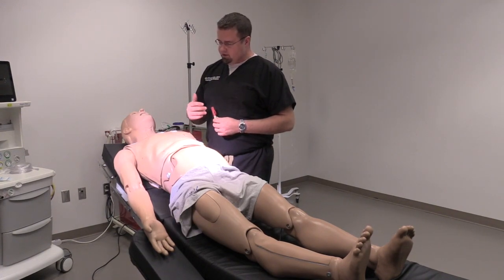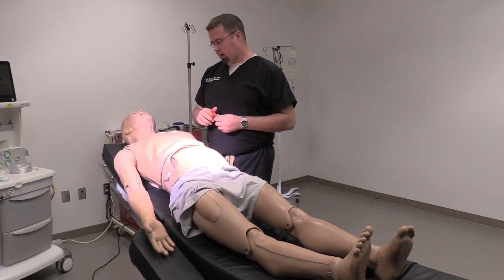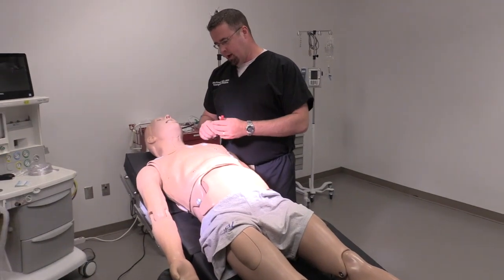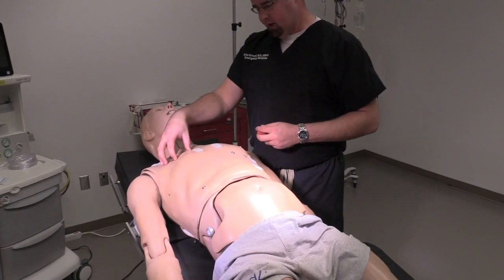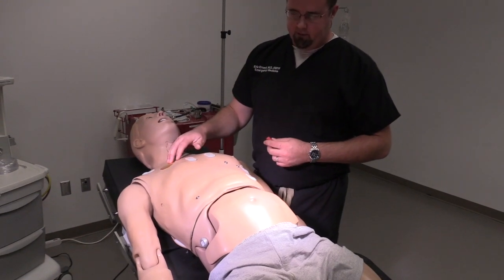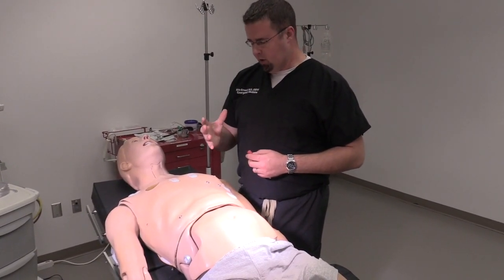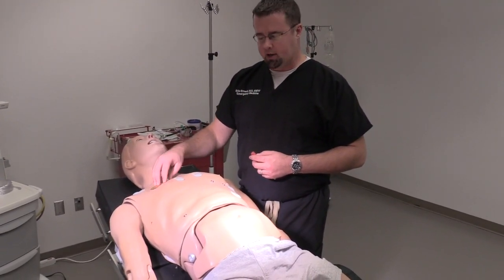Some tips and tricks: we basically want to get in between the second and third rib in the mid-clavicular line. What I teach people, and for those who have done the cadaver labs, is to think of about a baseball-sized area on the anterior chest, above the nipple and below the clavicle, as a bit of a no man's land. If you're anywhere in this general vicinity, especially if you're having trouble identifying landmarks, and this person has a completely collapsed lung from a pneumo or hemothorax, the lung tissue is going to be moved well out of the way. You're not going to be hitting any vital structures when you're going into that area.